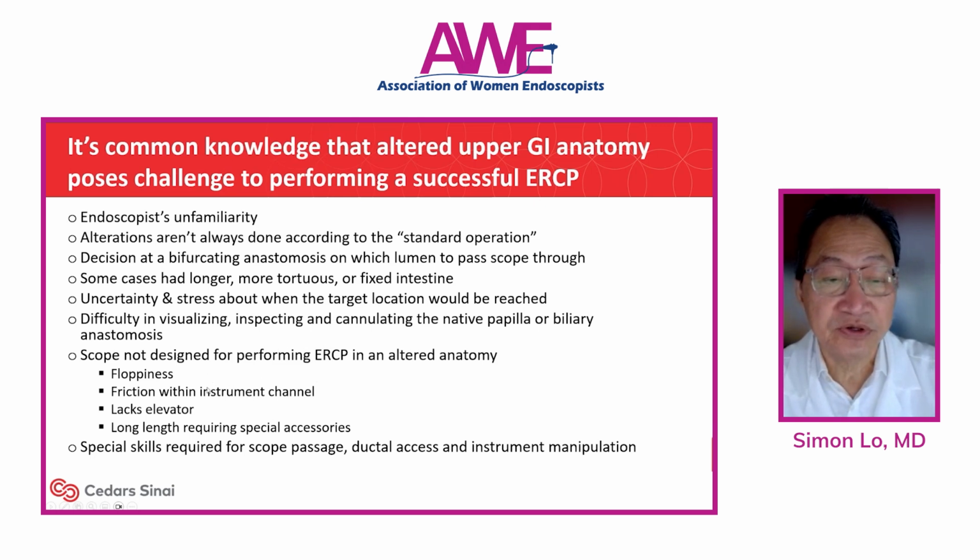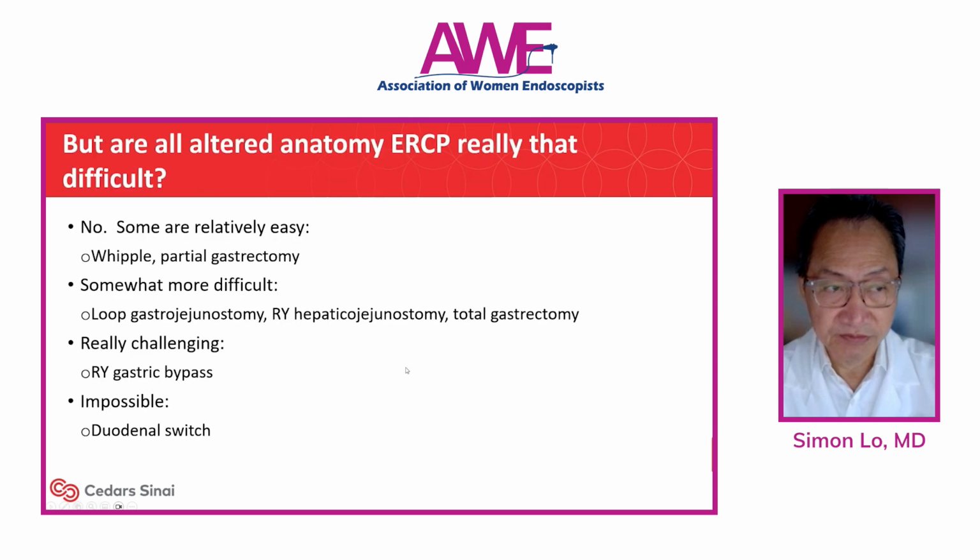And also, if you're using an enteroscope to perform ERCP, these scopes are floppy, have friction, lack an elevator, and can require long accessories to perform the procedure.